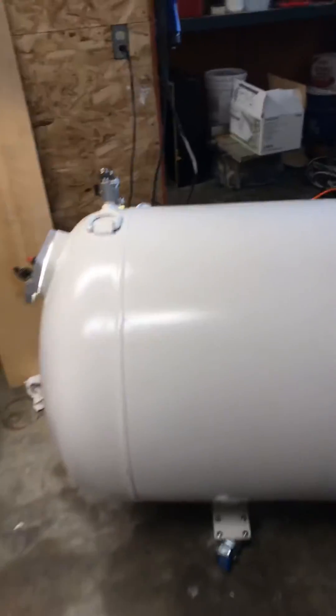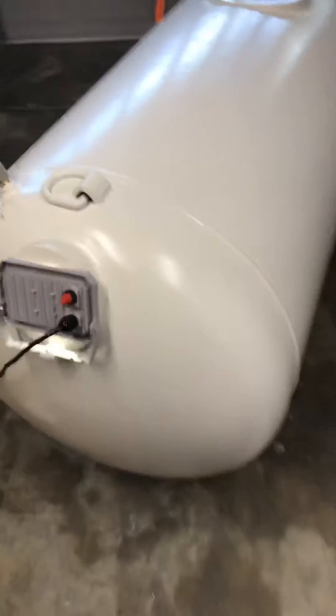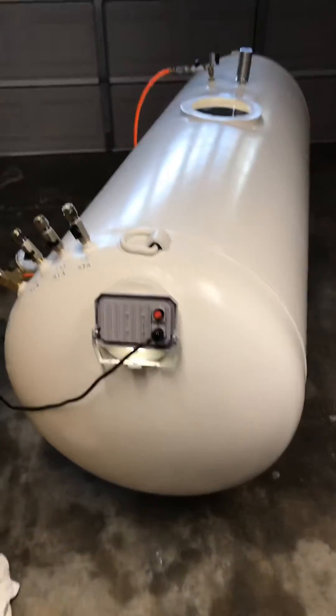In the first video I'll just do a simple run-through. So this is a 7 foot by 30 inches round, used to be a propane tank, that I converted into a hyperbaric chamber.